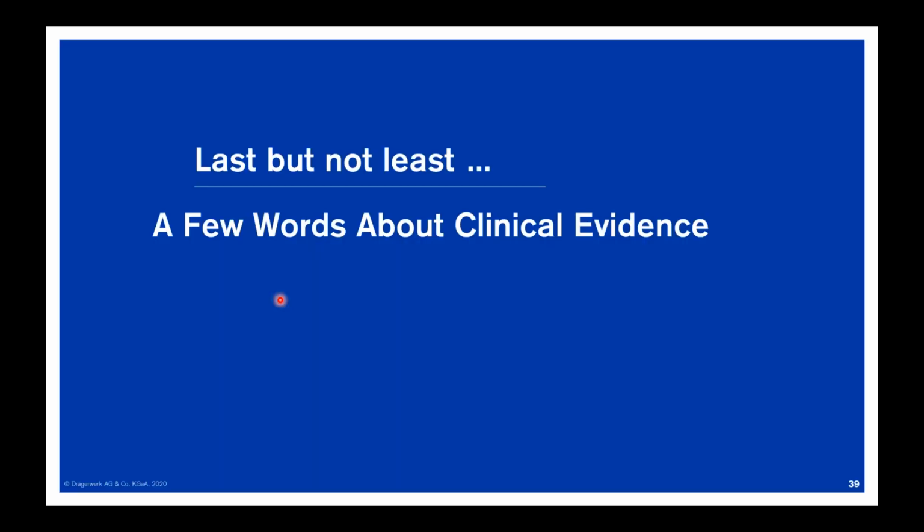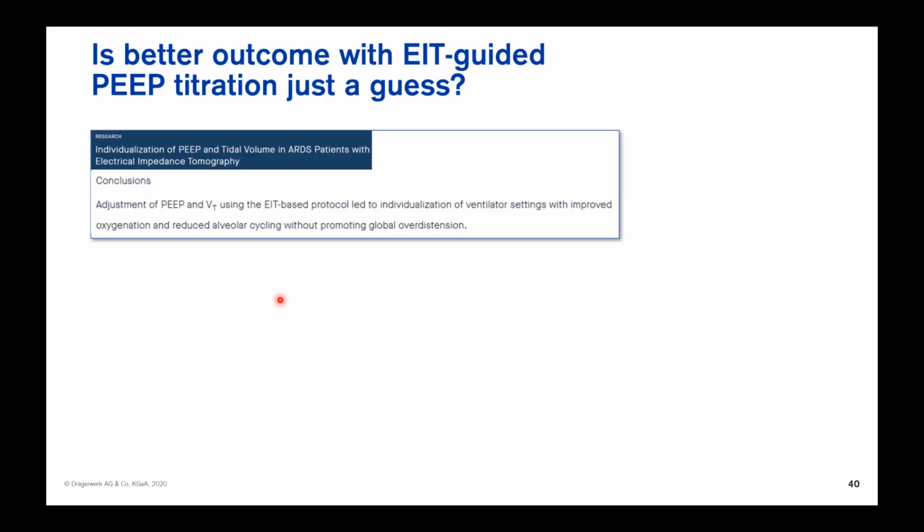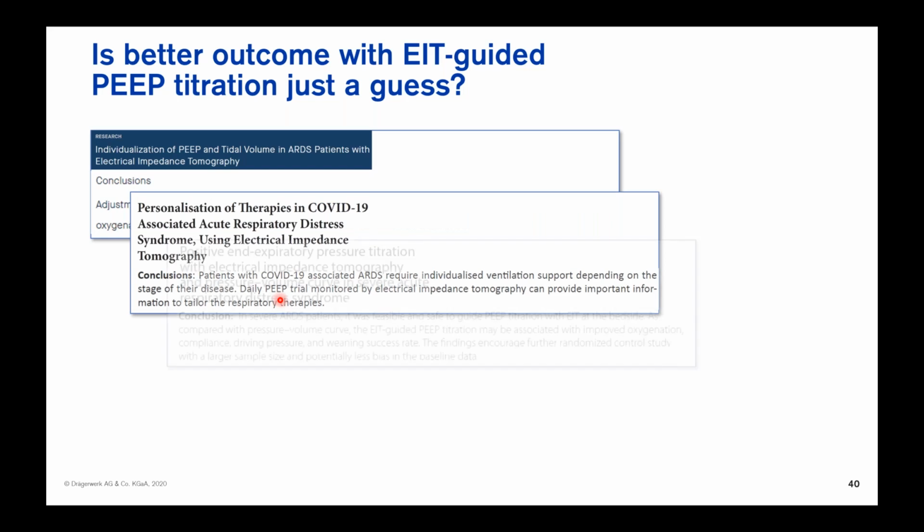Okay, but then of course we can ask ourselves, does this approach based on EIT really make a difference in the clinical outcome of our patients? And then I would just like to present you the first outcome studies, which have already demonstrated benefits.